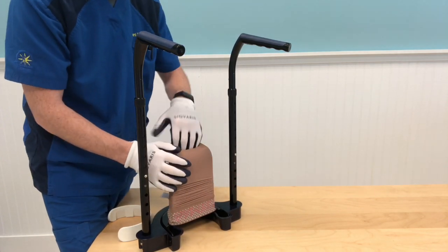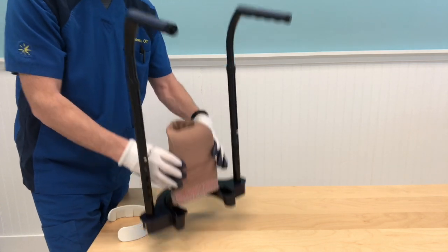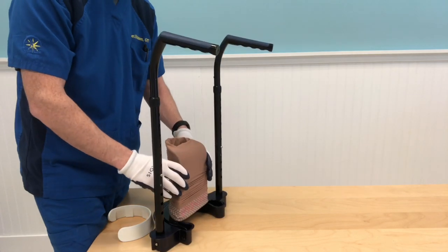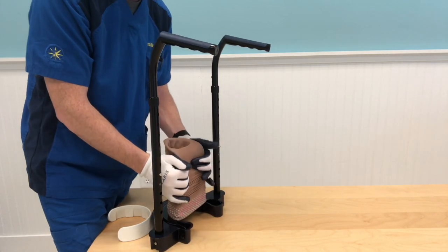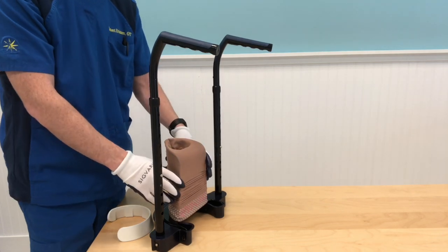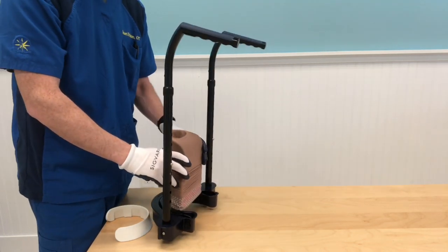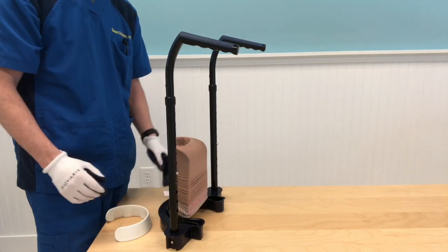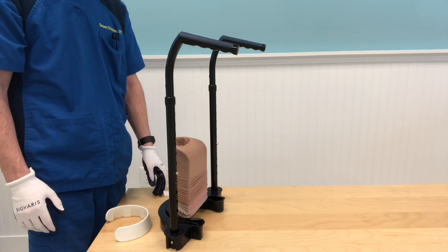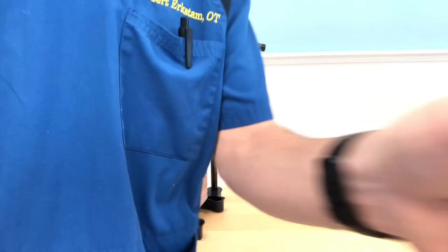And you continue to load it almost till you get to the toe box. I still have a pretty deep hole there, so I'm going to load a little bit more, and you can see I'm pulling it more towards the front because the hole was pretty far towards the back of the device. And now it is loaded and it can be used for putting the compression sock on.